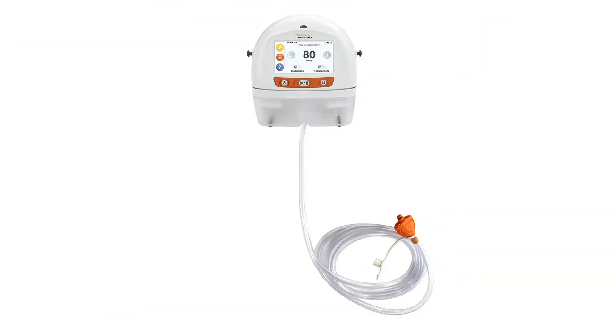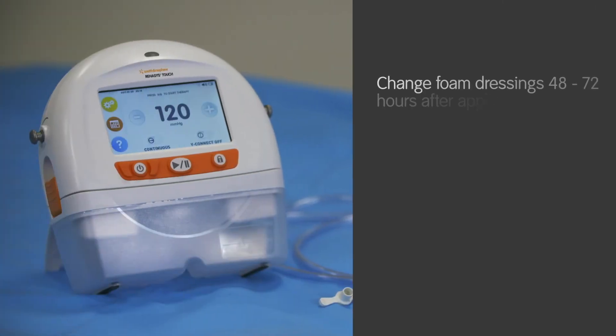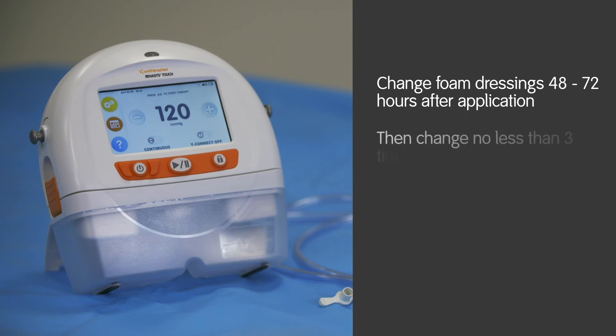The Renesys touch device and system tubing should be positioned no more than 19 inches (50 cm) higher than the wound to ensure optimisation of therapy and prevent therapy interruption. Foam dressings should be changed every 48 to 72 hours after initial application of therapy. If no leak is present and the patient is comfortable, dressing changes should occur no less than 3 times per week.